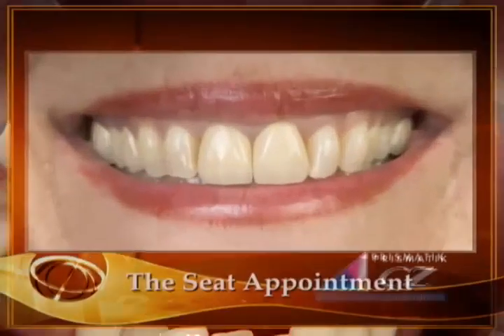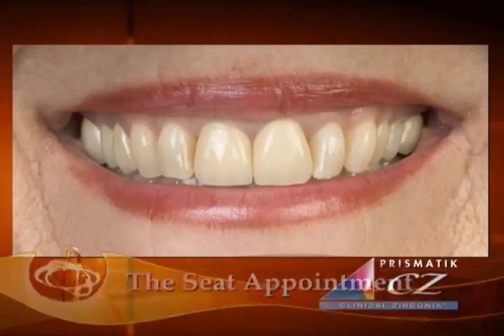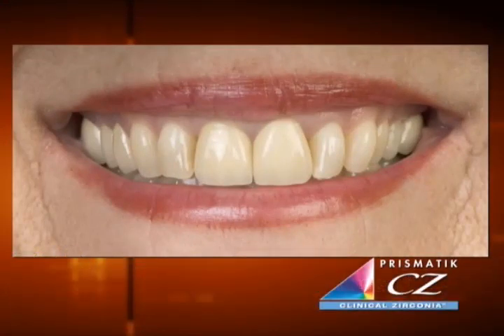Now here the permanent CZ crowns are into place. Now those fit right up against the papilla, as you can see here, because that's what this is all about, is making sure those fit nice and tight against the papilla.